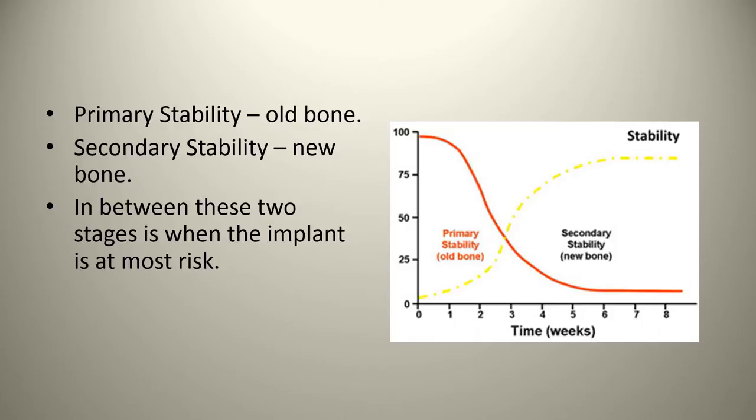And so the 21-day mark is really when you want to make sure that there are not going to be any excessive forces placed upon these implants. Even though many times we can be fooled, we put a bunch of implants in, they have excellent primary stability, the patient comes back and we immediately load them with the prosthesis, and they happen to be a heavy bruxer or have some sort of unrealistic expectations with respect to the actual function capabilities of their implant-supported prosthesis, we ask ourselves what happened in this sort of case, and the graph will explain what happened.